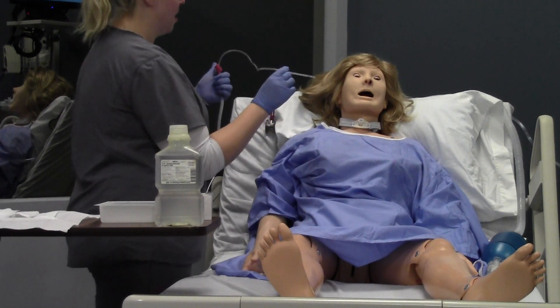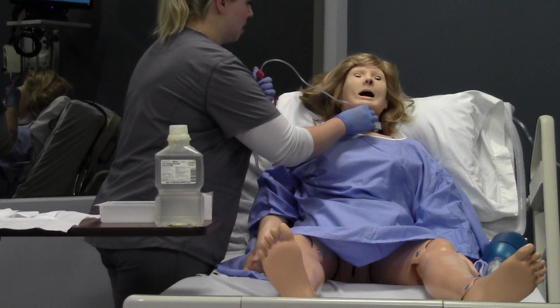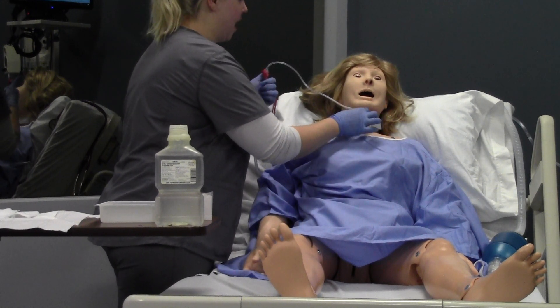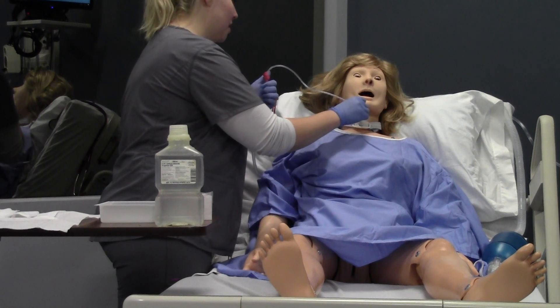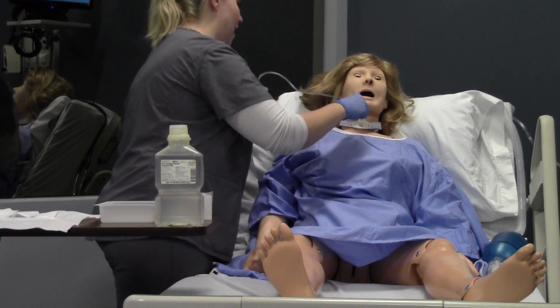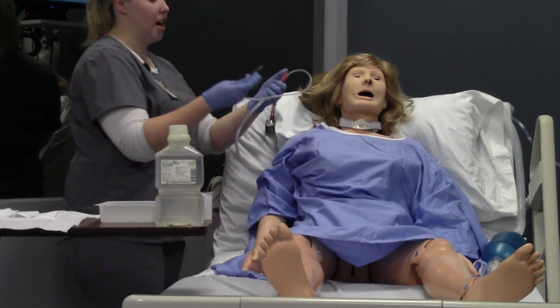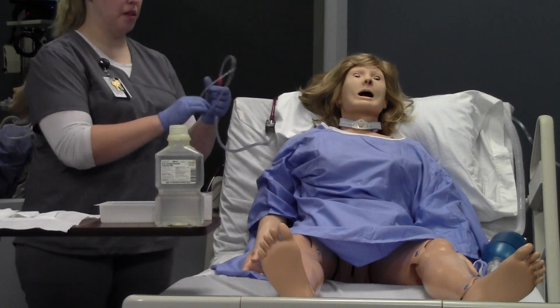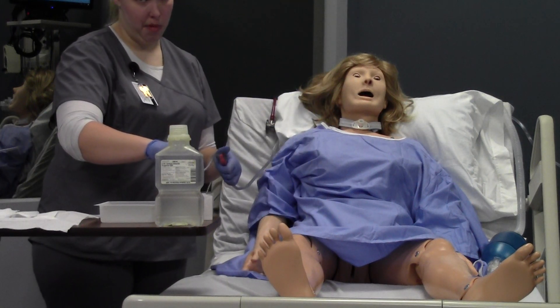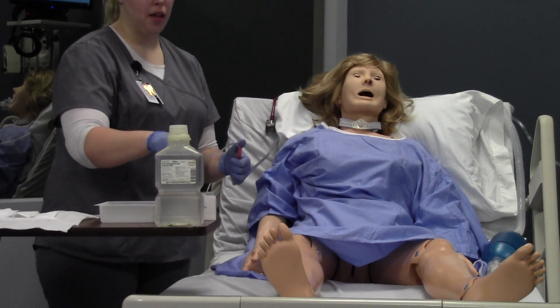I'm going to let my patient know: on the count of three I'm going to go down and suction. One, two, three — I go right down the middle. Make sure this hand stays sterile. Don't touch the trach or anything around it. Go down 15 to 20 centimeters, then suction and twirl out. When done, have your partner give the patient two breaths while you're lubricating the catheter. After the first pass they give two breaths; after the second pass, two more breaths while you're cleaning the catheter.